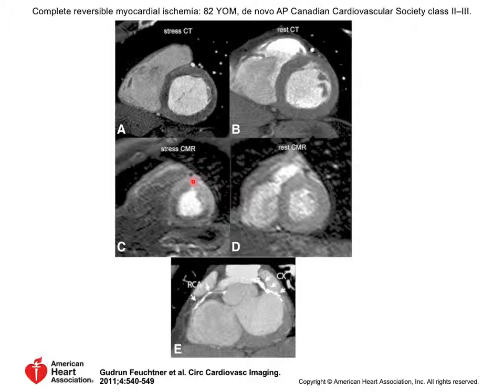And if one of the vessels is incapable of reaching that flow rate, you will see a shadow or a dark spot here in which the contrast agent didn't get in there at the rate at which it's getting into the normal myocardium. And so this is a positive stress test on MR in the sense that you get this darkening here. In this paper, the authors claim that they confirmed this both on CT and MR in this patient. Fair enough.